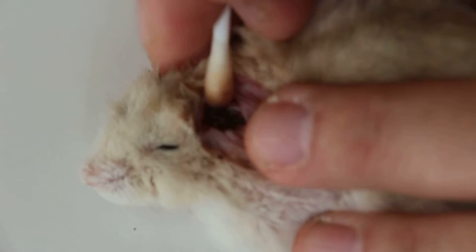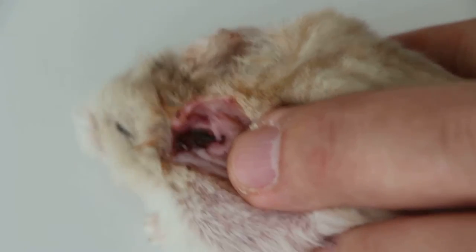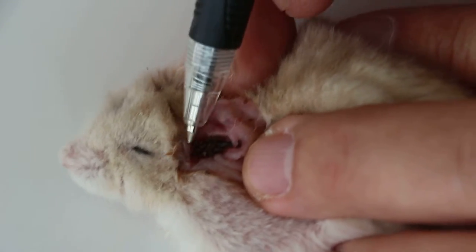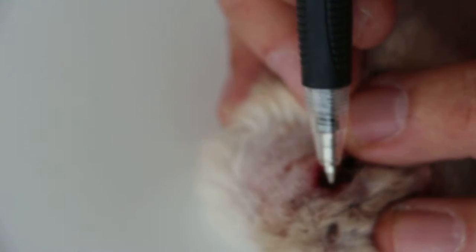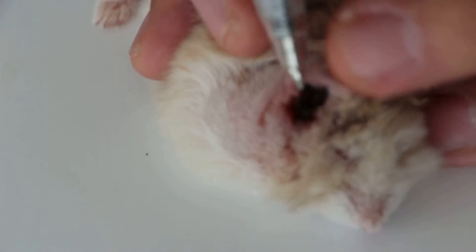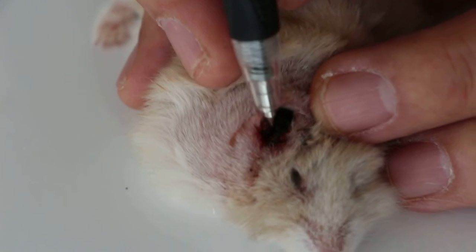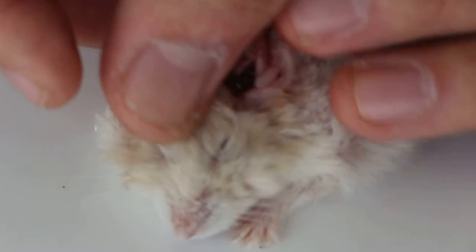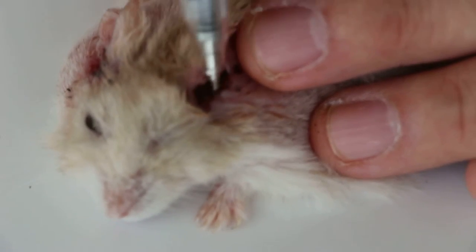Now you can see the lateral wall — the vertical wall has been cut off. A rectangular piece is cut off using electrocautery on the left ear as well as the right ear, so it's exposed. There's no more side wall — the lateral wall of the vertical canal. So any warts there can be easily taken out either by the owner or by the vet later. The horizontal canal opening is there, and in the dog it is quite easily seen after this surgery.